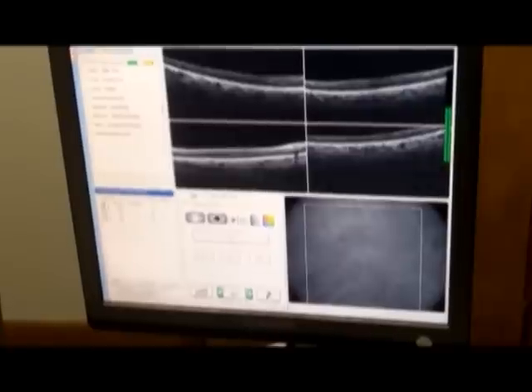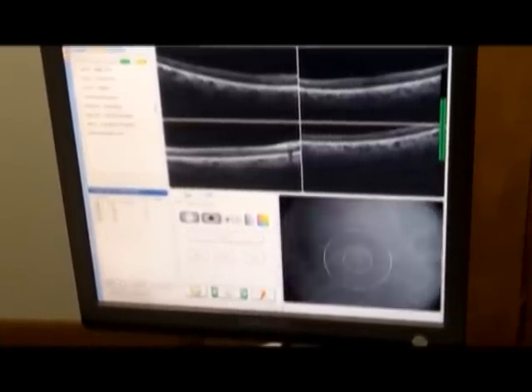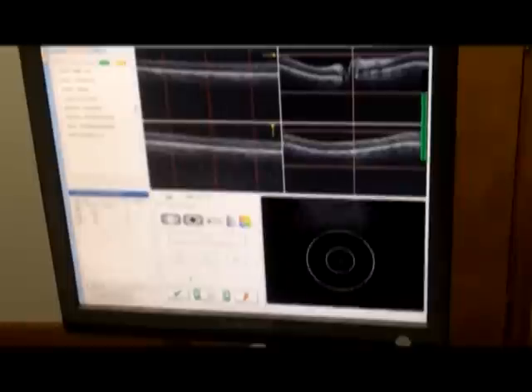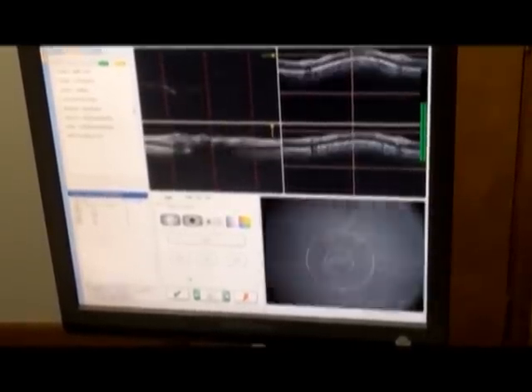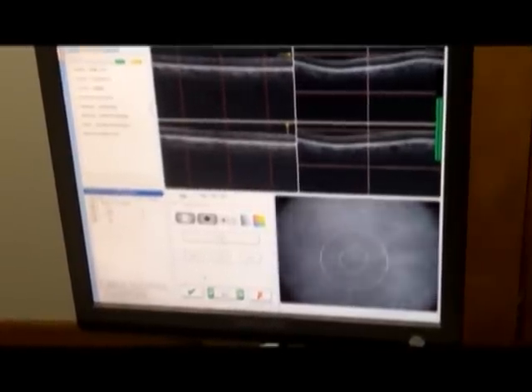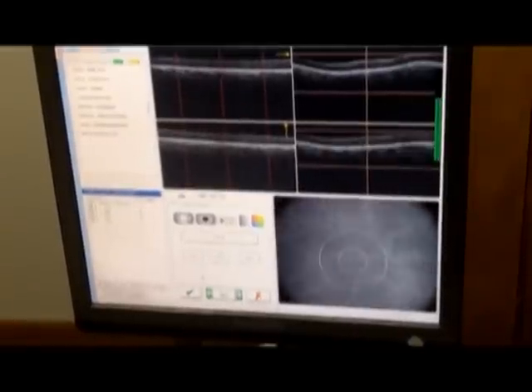Hitting the four lines automatically takes me to the next scan for that eye — the optic nerve head. Because it's his right eye, the blue light has now shifted to his left. The patient starts looking around because they can't see it — it's gone off to the left and out of their viewing area. I slide the instrument over so he can see it. For the right eye, instruct the patient to look to the left; it's vice versa for the left eye.